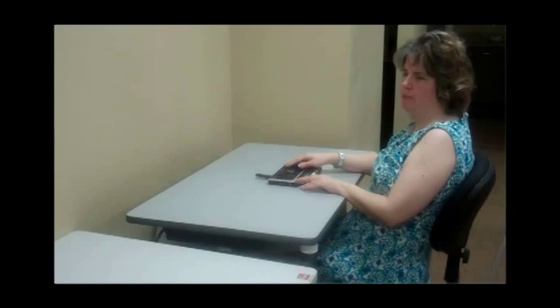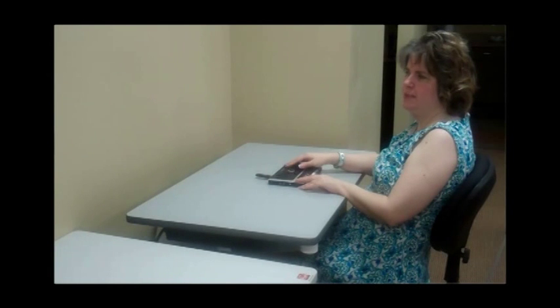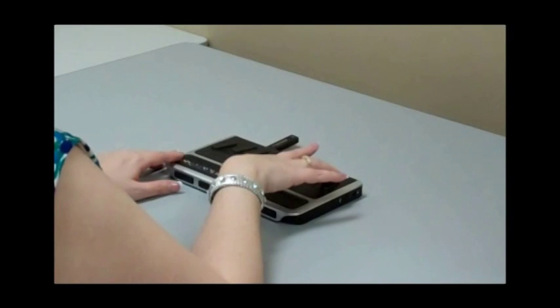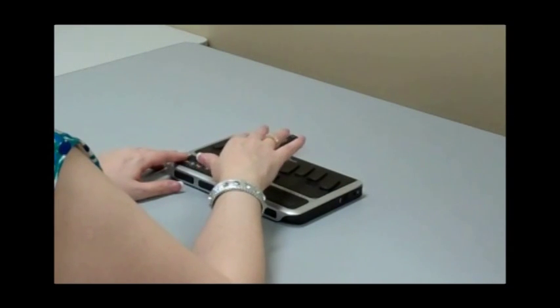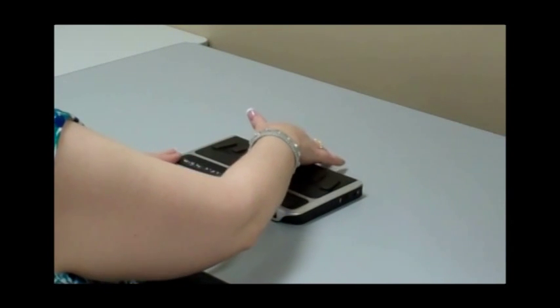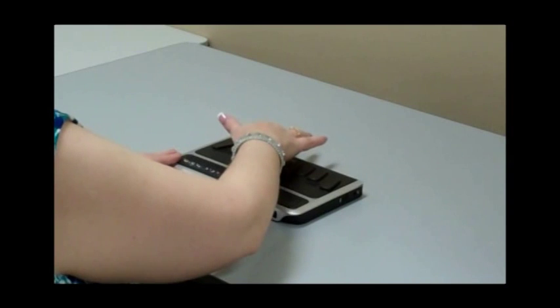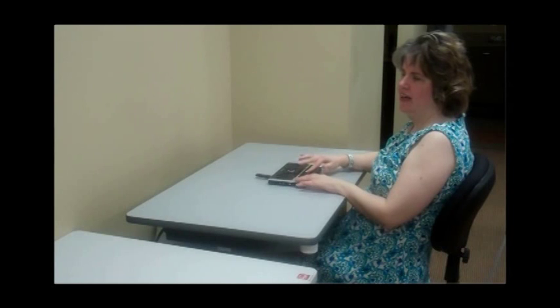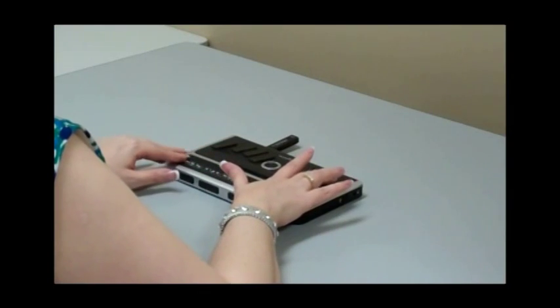I am going to create a document. Where I'm moving through the menu, you move through all the menus with the space bar. The first option was create a document. The second option is open a document. So I'm going to press the enter key here. Drive. Press enter for hard disk. I don't know if you can see this, but on the back of here I've got a little thumb drive plugged in to the APEX that has a lot of different types of files that I might use in a day. That's called the hard disk, so we're going to stick with that.